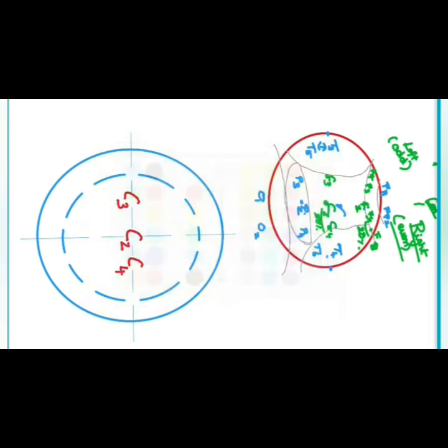Now we'll move to temporal. T3, and this is just 10 percentage difference, so T5. Right, that would be a mistake because it should be T4 and T6, since on the right only even numbers are allowed, whereas on the left you can have odd numbers.